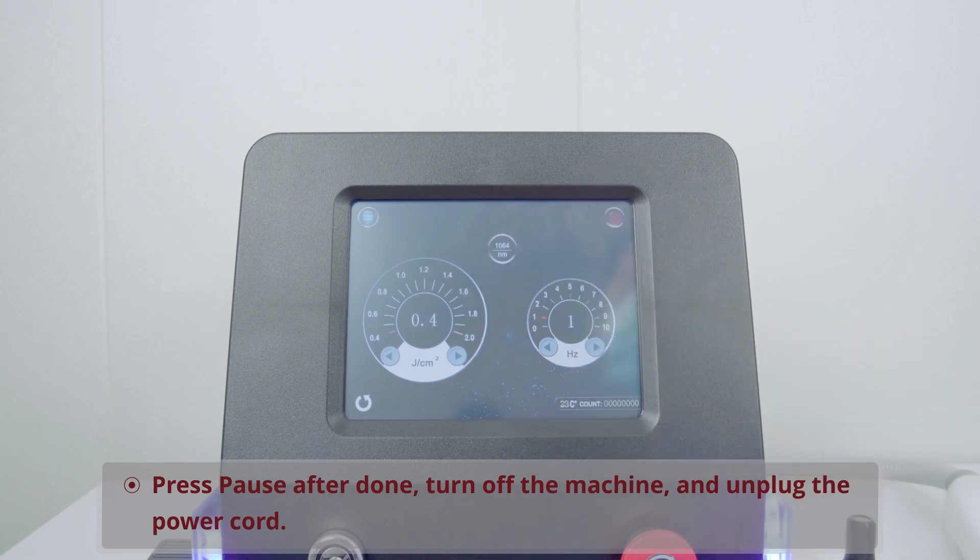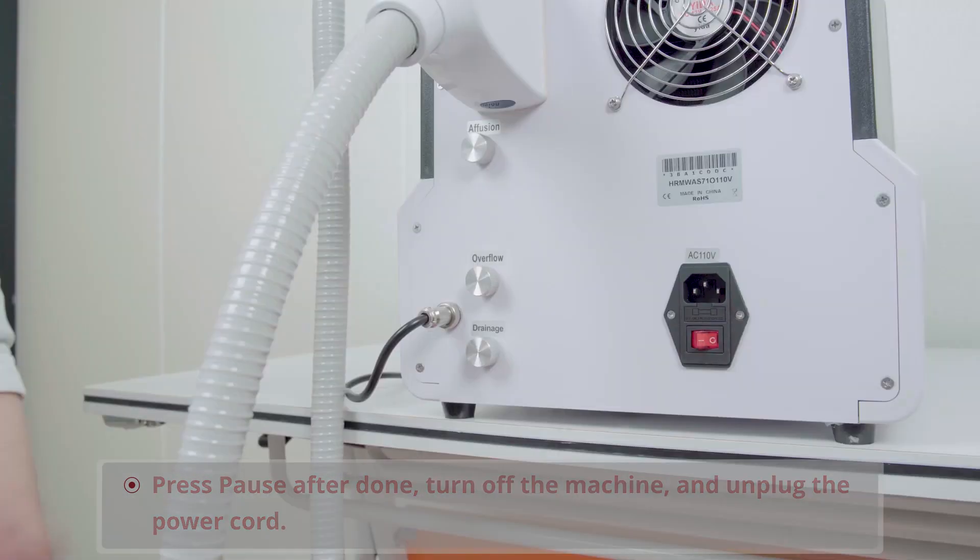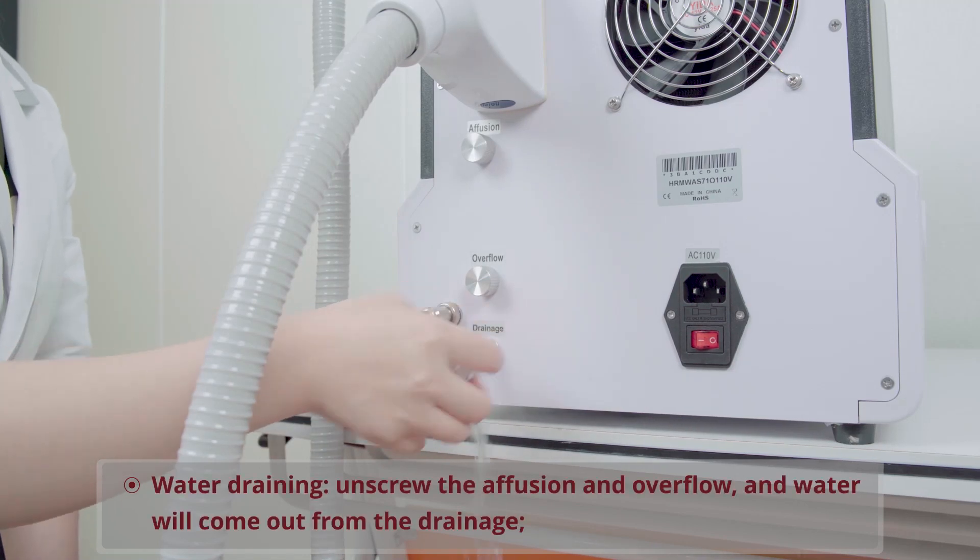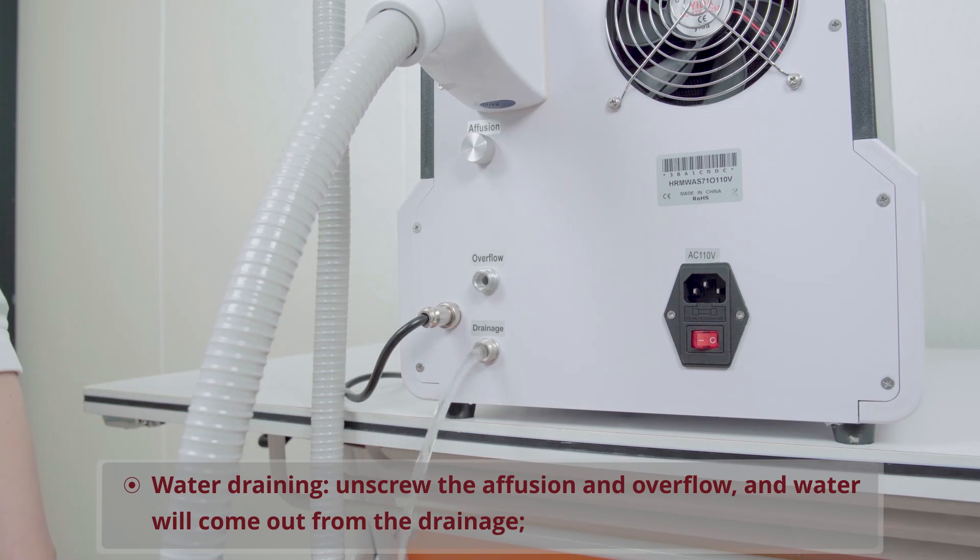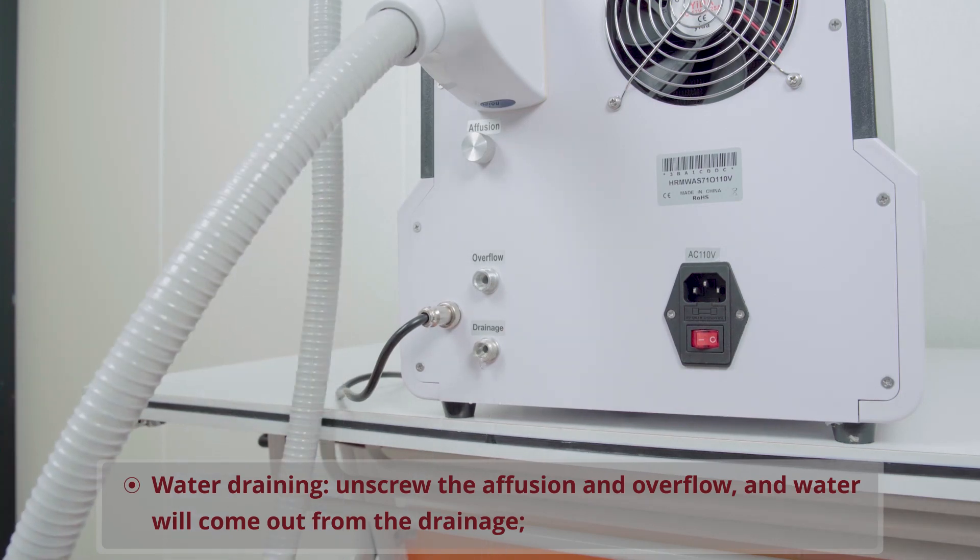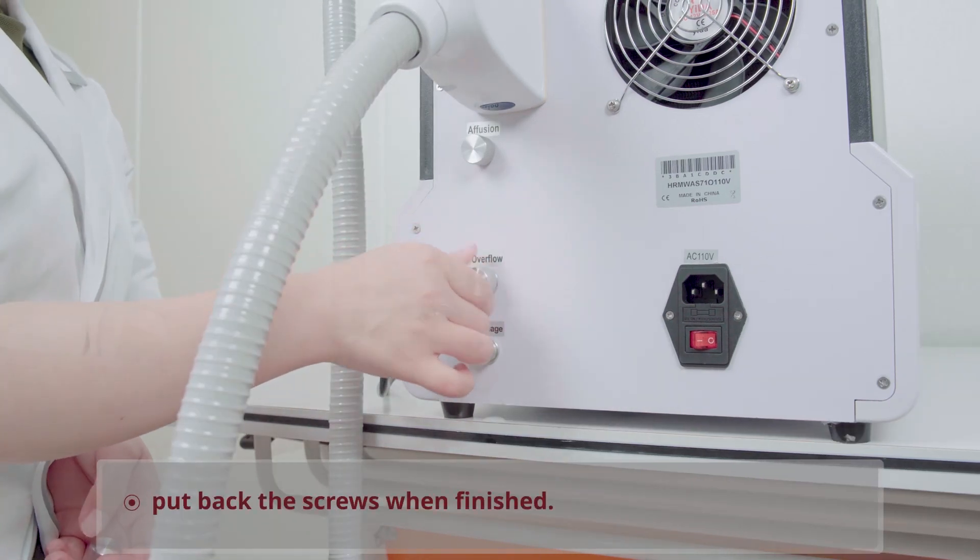Press pause after done. Turn off the machine and unplug the power cord. Water draining: unscrew the affusion and overflow and water will come out from the drainage. Put back the screws when finished.